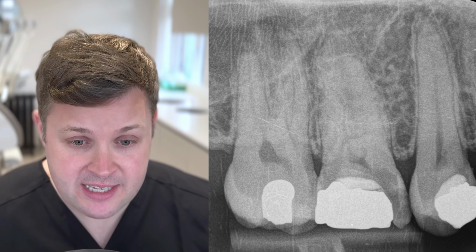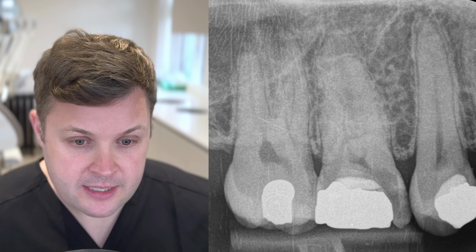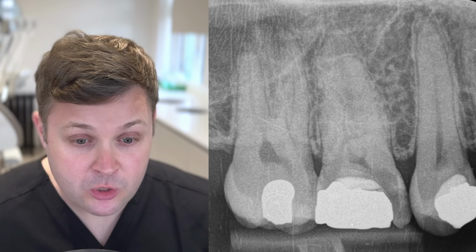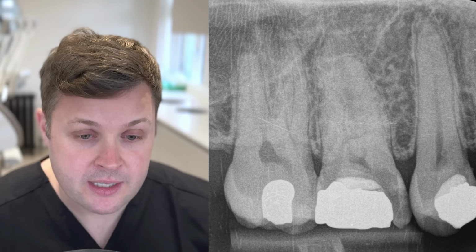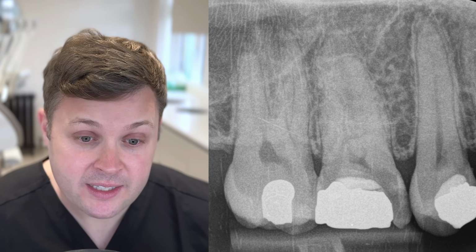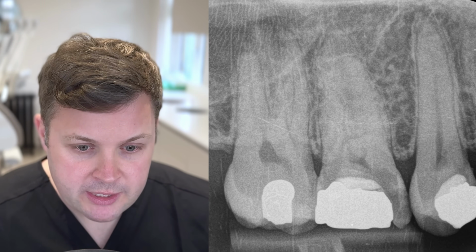This is a case of upper right 6, and we look at the X-ray here, and it looks very unusual, doesn't it? We can see that the root form here is probably conical in shape, although it's not entirely sure what shape this is, because when we look at the upper right 7 next to it, we can see there are obviously 3 defined roots here. And also another issue with this case is that we can't see any obvious canal space. Maybe if we squint our eyes, we can maybe see the palatal. But overall, this is an unusual case.